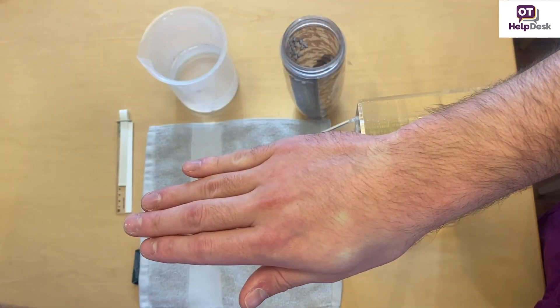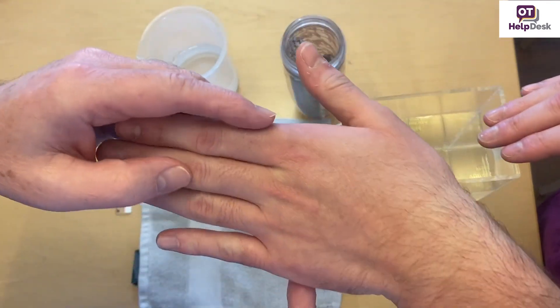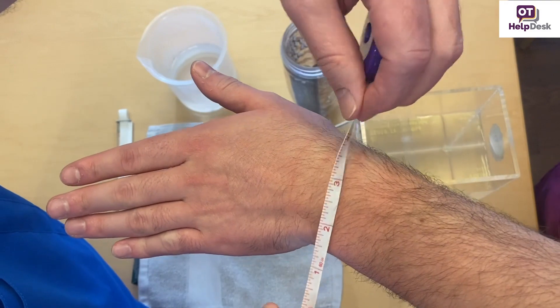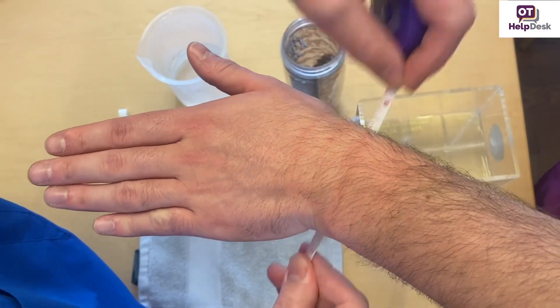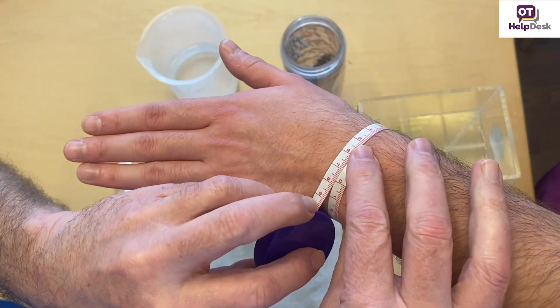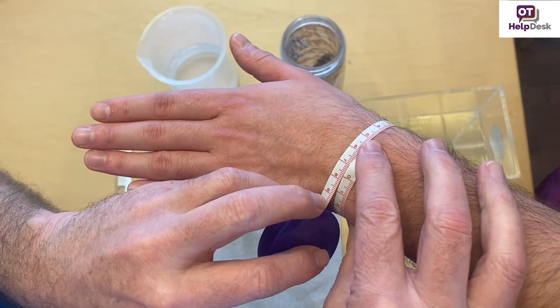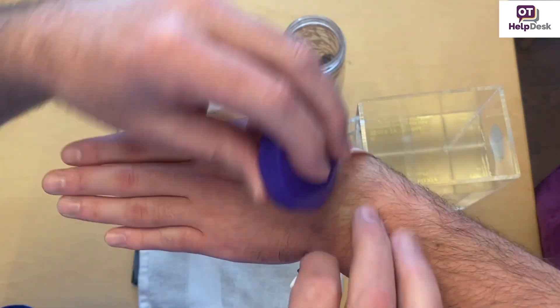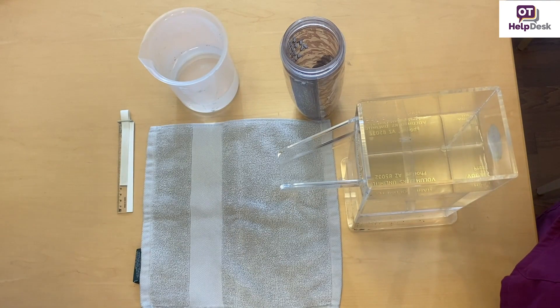Once we measure that, that's the first measure we take. Let's do both and compare. We'll compare the measure of Joseph's right versus his left. Joseph is about 17.7 — a little smaller. Are you right-handed, Joseph? I am. That's logical.